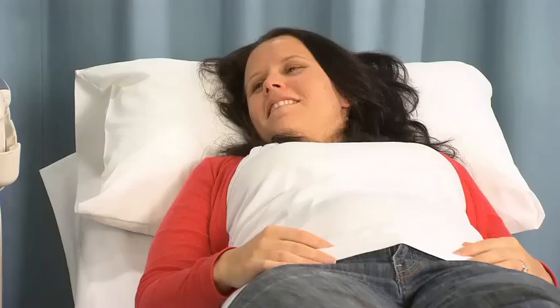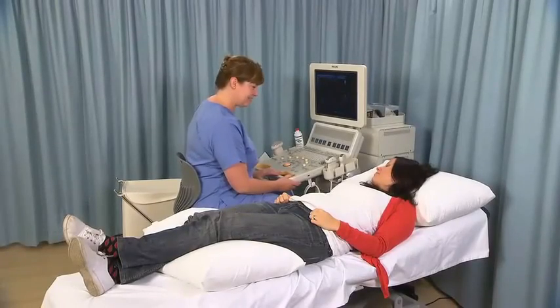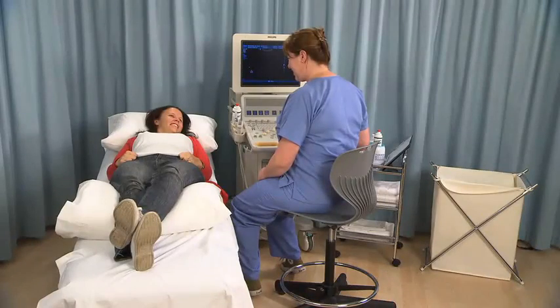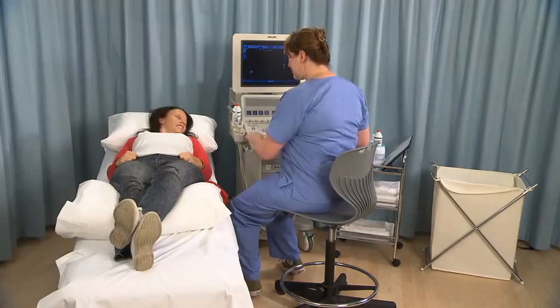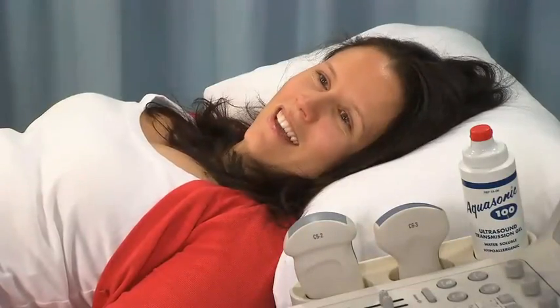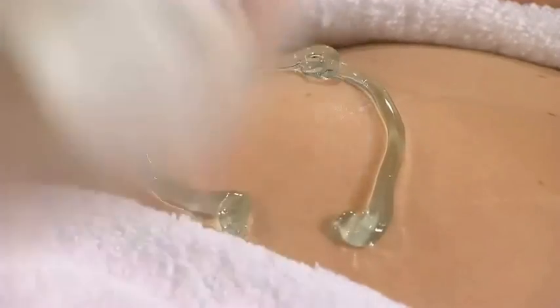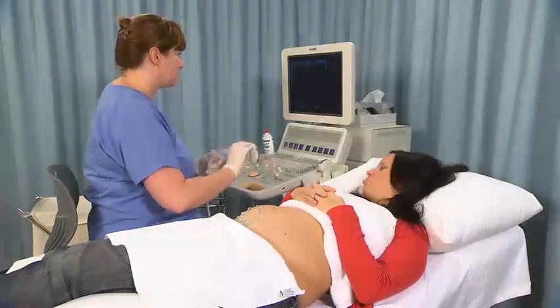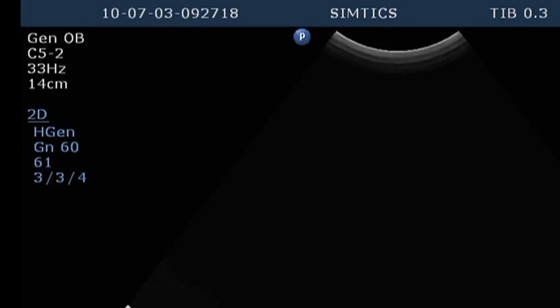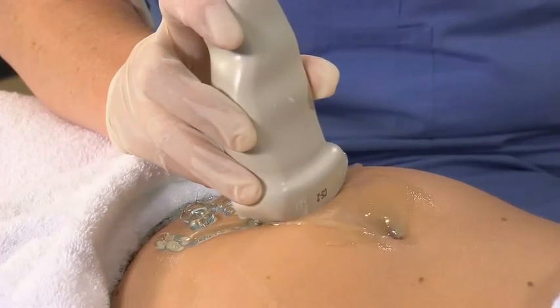Sit or stand next to the patient's right side with the ultrasound machine to the left upper end of the examination table. Expose the lower abdomen and apply gel as required. Select the appropriate transducer, confirm the correct transducer selection preset, and perform a survey scan of the maternal pelvis and fetus.